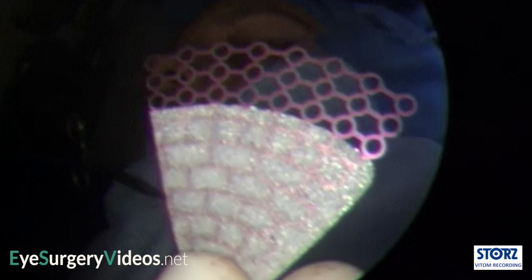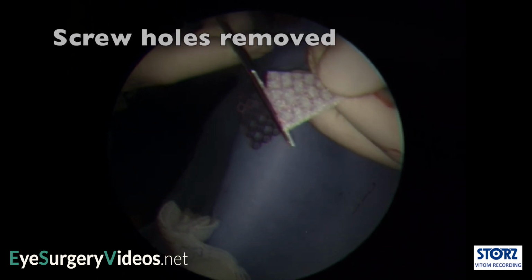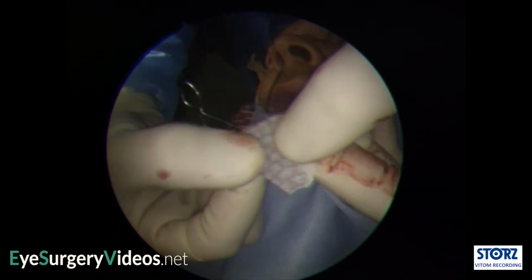Various materials can be used to cover the defect. They can be divided into autologous materials, usually bone or cartilage, and synthetic materials, which are either absorbable or non-absorbable. Non-absorbable materials, such as porous polyethylene, titanium, silastic sheeting, and mixtures of these, are more commonly used. These synthetic materials are increasingly widely used because of their ease and speed of use, the avoidance of donor site morbidity, and the excellent long-term reported results, although they probably have slightly higher infection and extrusion rates than autologous materials. Nevertheless, the complication rates are extremely low.